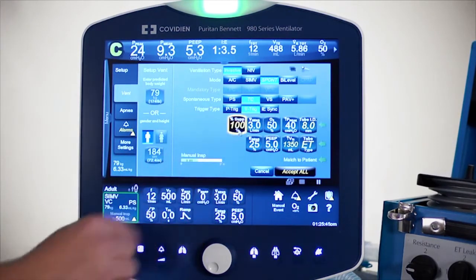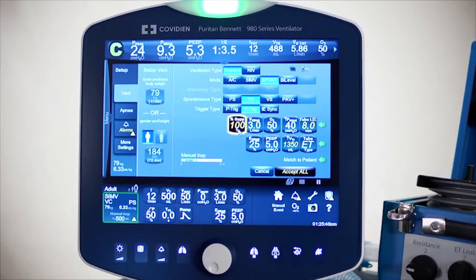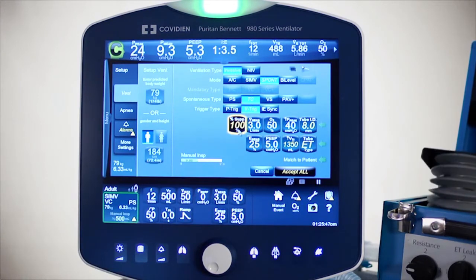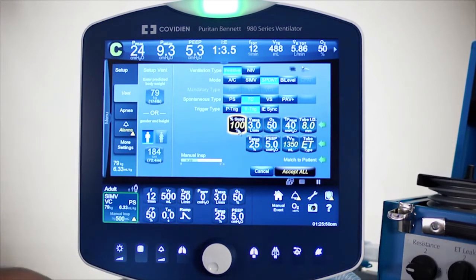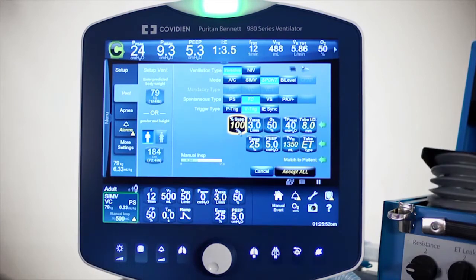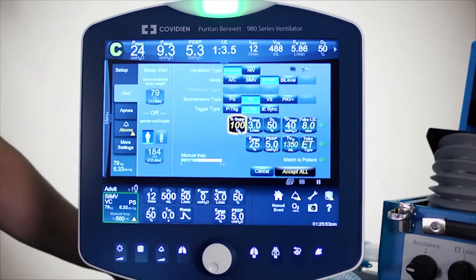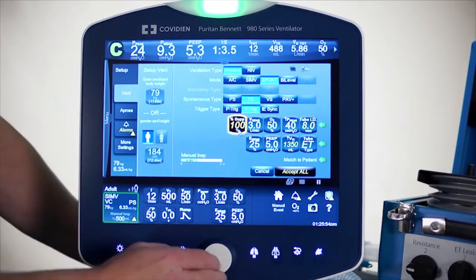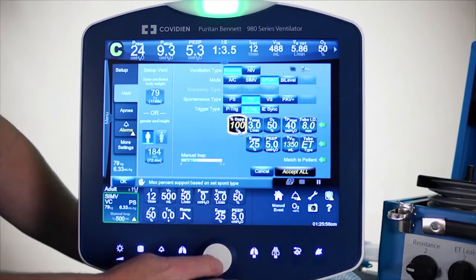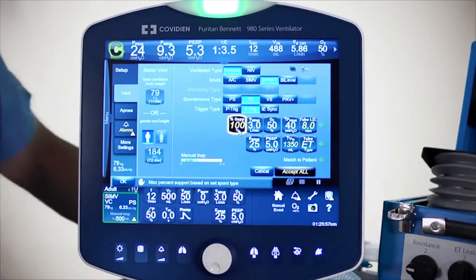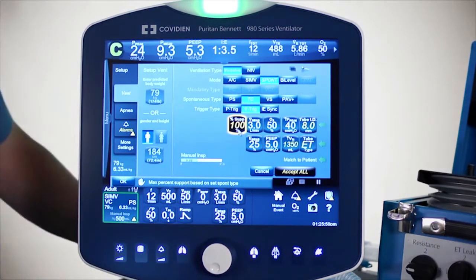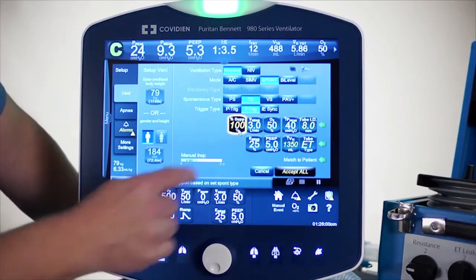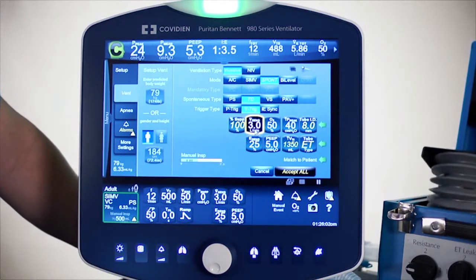There is a percent support setting for how much the operator wants to set in terms of overcoming the airway resistance and the work associated with breathing through artificial airways. You can adjust that anywhere from 10% all the way up to 100%. I'm going to go ahead and leave it at 100%. There's your normal sensitivity.